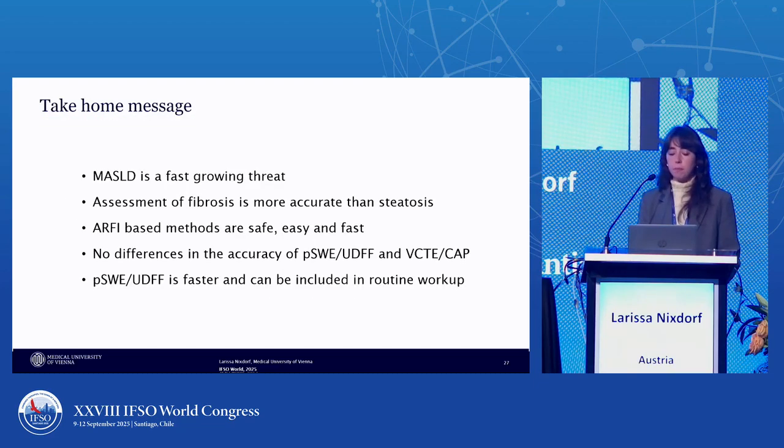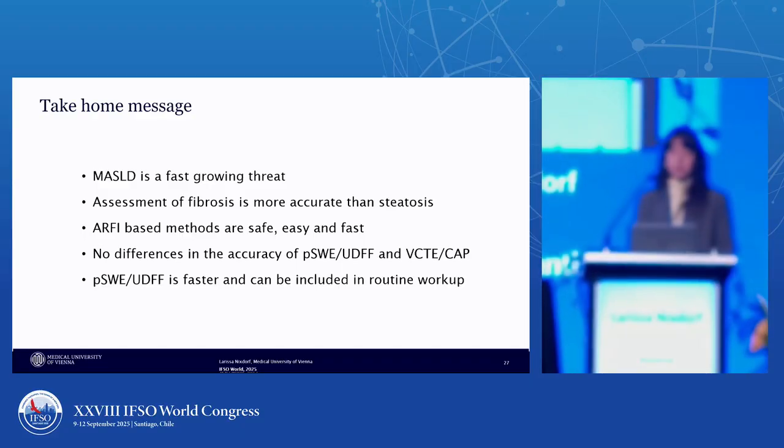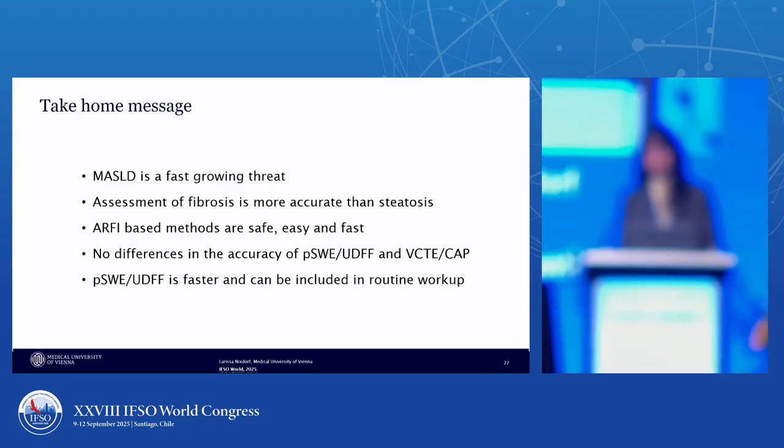To sum it all up, MASLD is a big problem and still growing and affects all of our patients. The non-invasive assessment of fibrosis is more accurate than the one of the steatosis. The acoustic radiation force impulse-based methods are safe, easy, and fast, so these are the newly developed ones.